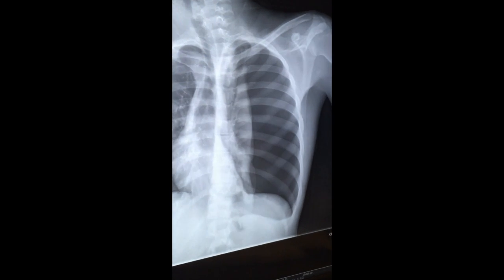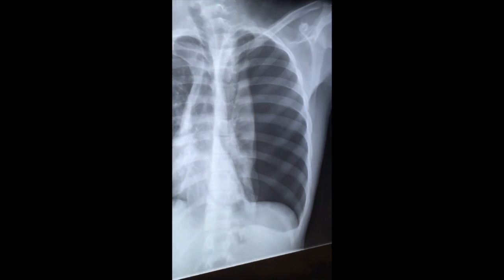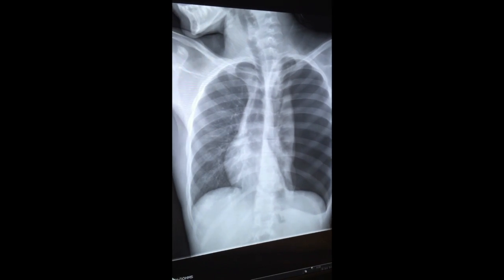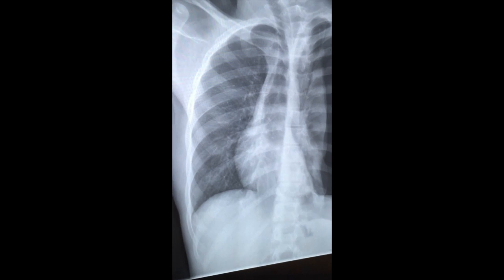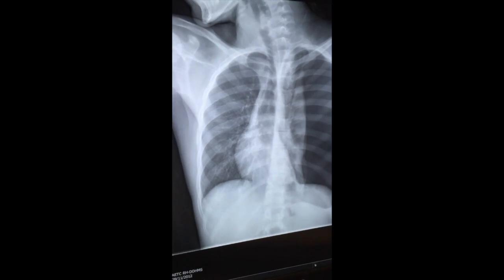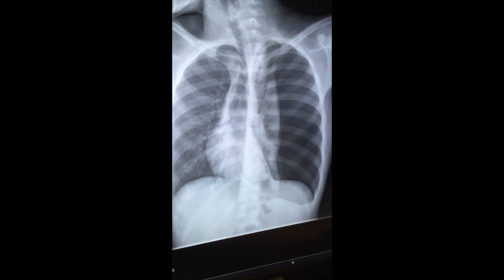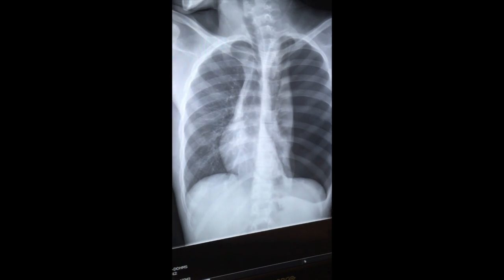This is an x-ray of a 14-year-old child in a PA view, and it was diagnosed as tension pneumothorax.